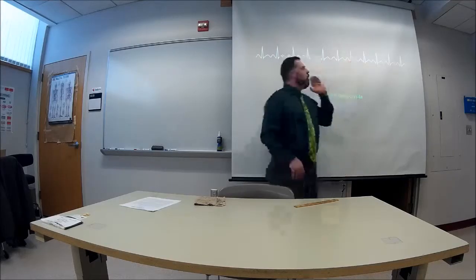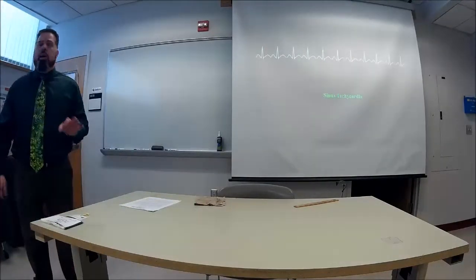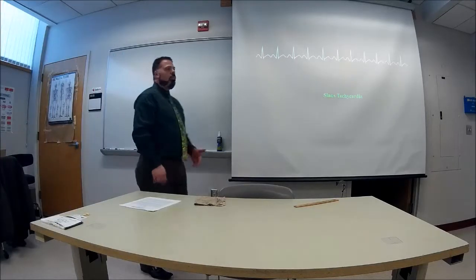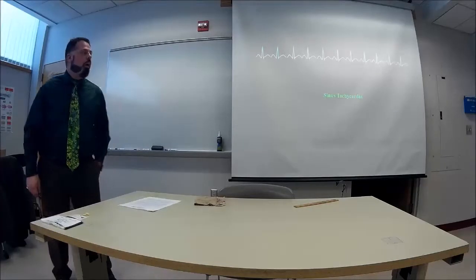Even though this is fast, over 100 beats per minute, it's tachycardia, but calling it sinus tachycardia also gives us more information, that there isn't anything wrong with, let's say, the P wave or the QRS.